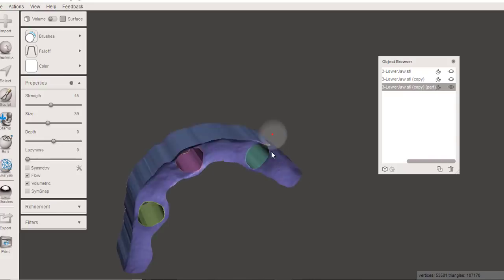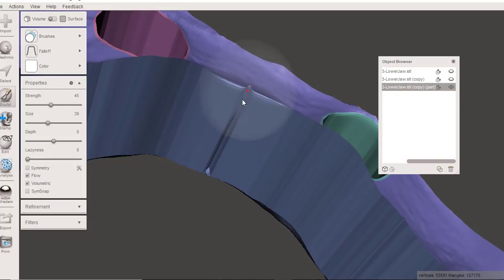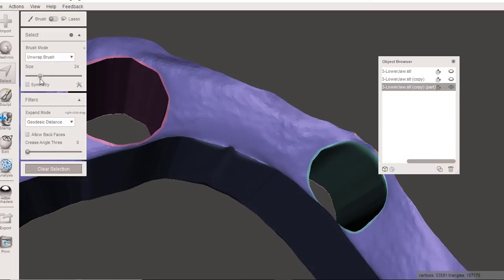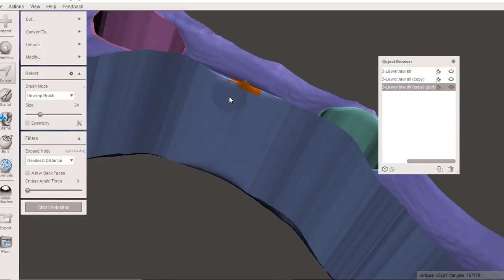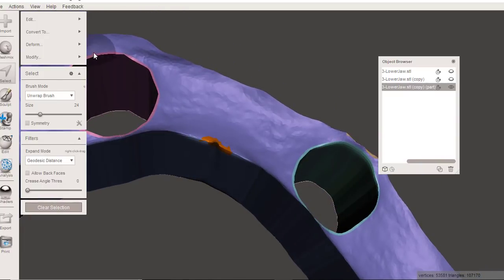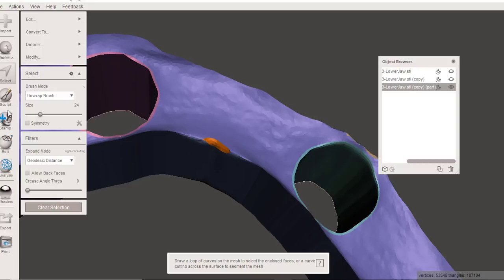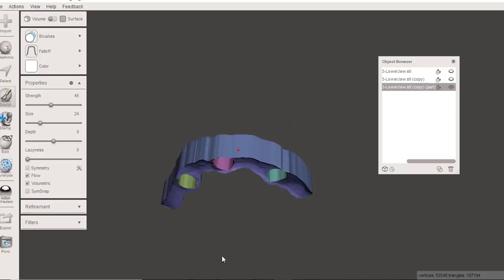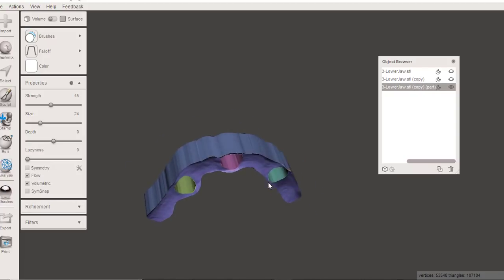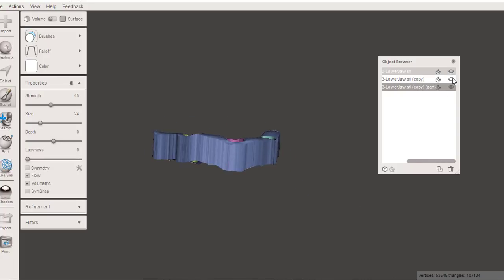I don't get too crazy with my smoothing at this point. I just want to get rid of any pieces of mesh that are crossed over one another like this. And once again, if there's a little piece that is not cooperating, I could just select that and erase and fill it. Smooth it out. Okay. So hopefully you notice that the anatomy is following exactly with the ridge here. It's going to sit a perfect 0.3 over the top of the ridge.